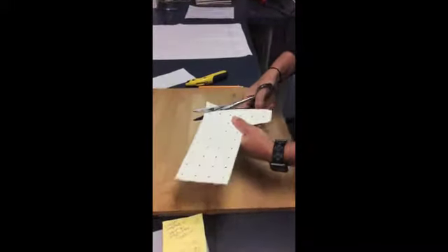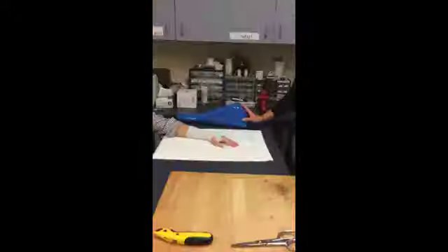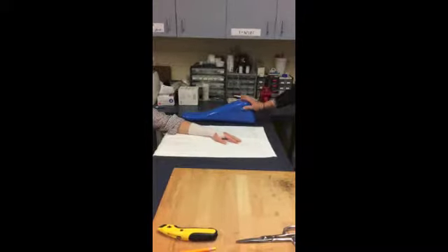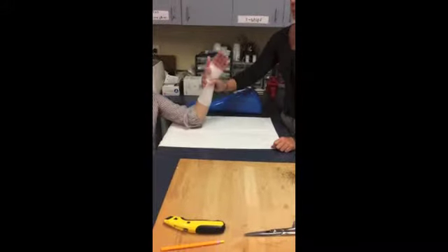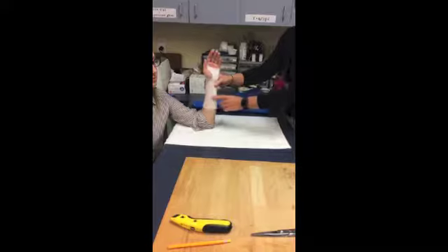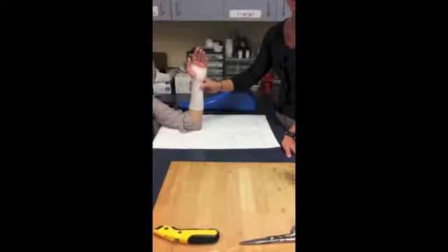Then, once it's cut, throw it in the heat pan and heat it up. Another option is to use a ramp if you need gravity to help you with the splint, or you can have the patient come up like this. Also make sure that the patient is wearing a sleeve in case they just had surgery or if they're sensitive.